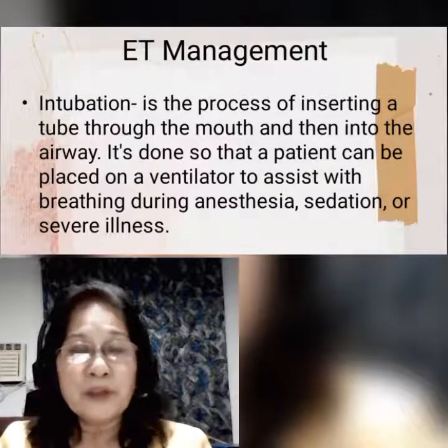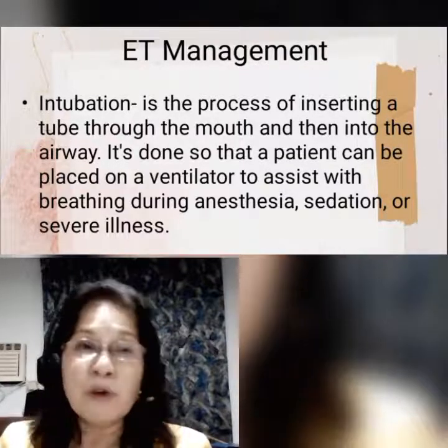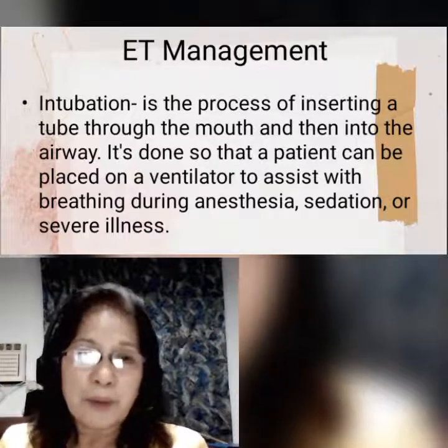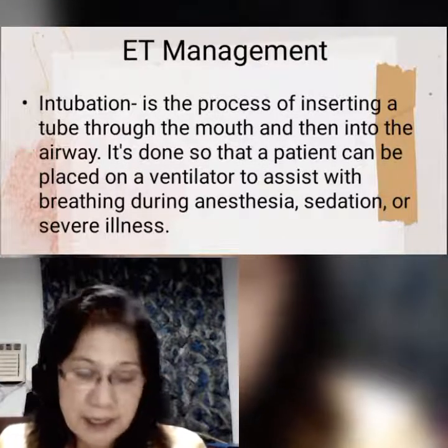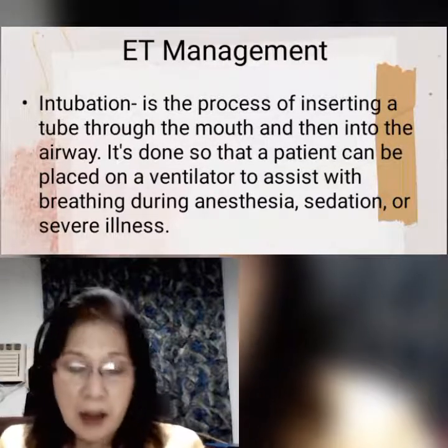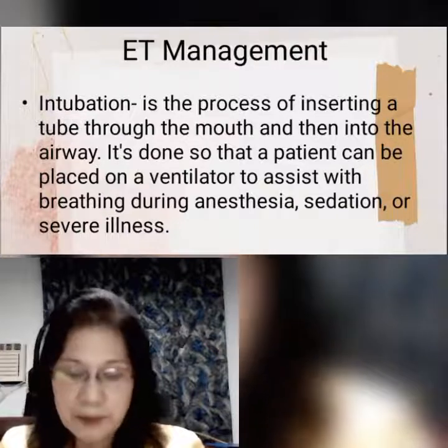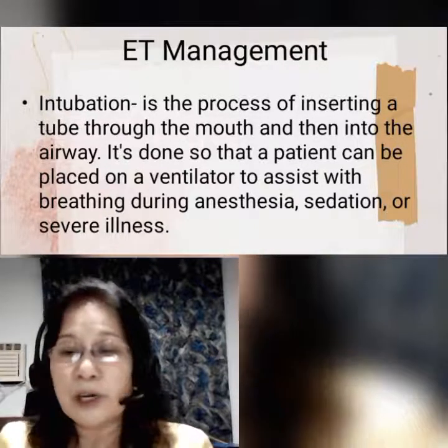Another purpose of ET management is to remove blockages, like for example mucus secretions. And then of course this helps the patients breathe when they have collapse of the lungs or they have heart failure or trauma. Okay, so this is how the patient is intubated.